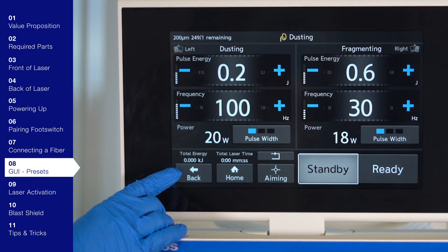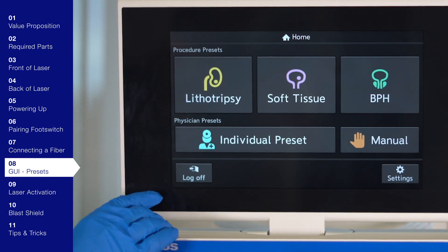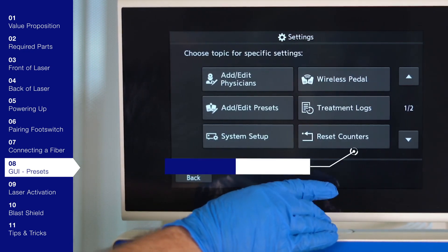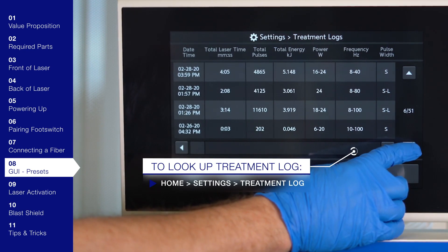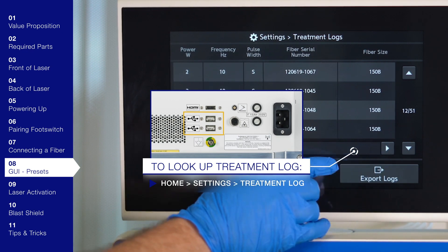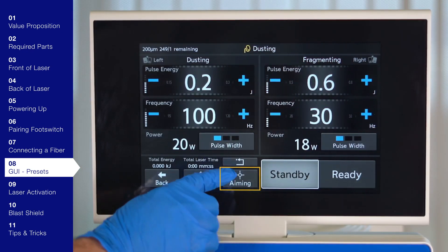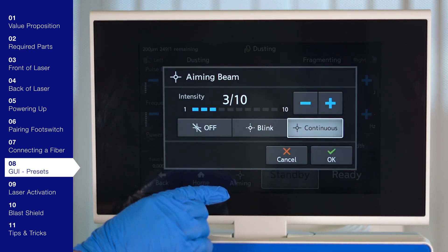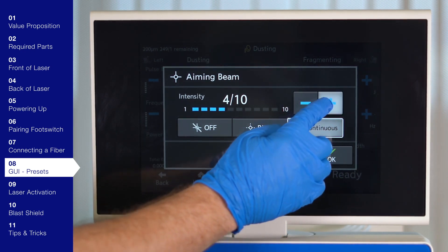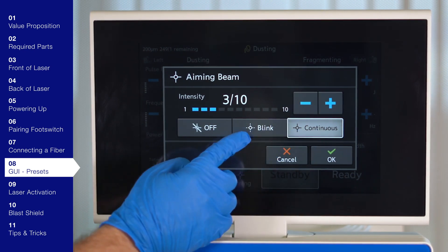This laser maintains a laser log. In case the laser was shut down before retrieving treatment information, this can be recalled by pressing the home screen button, the settings button, then the treatment log. This data can be exported via the USB port located in the back of the laser. To adjust the aiming beam, select the aiming beam button on the treatment screen. This is based on physician preference, so adjust the intensity accordingly. The aiming beam provides three options: blinking emission, continuous emission, and no emission.